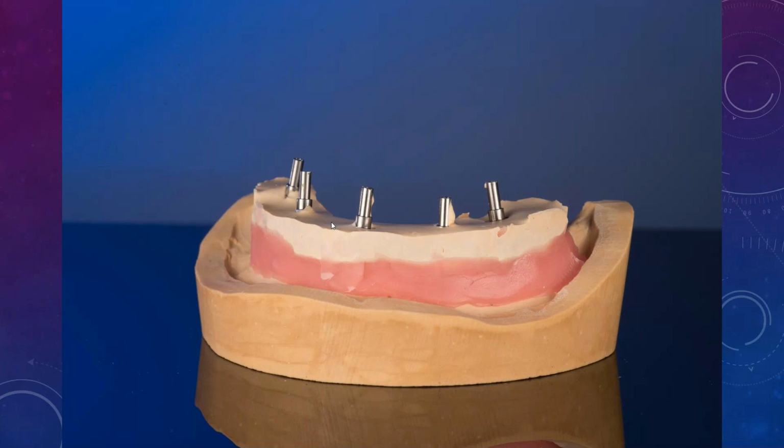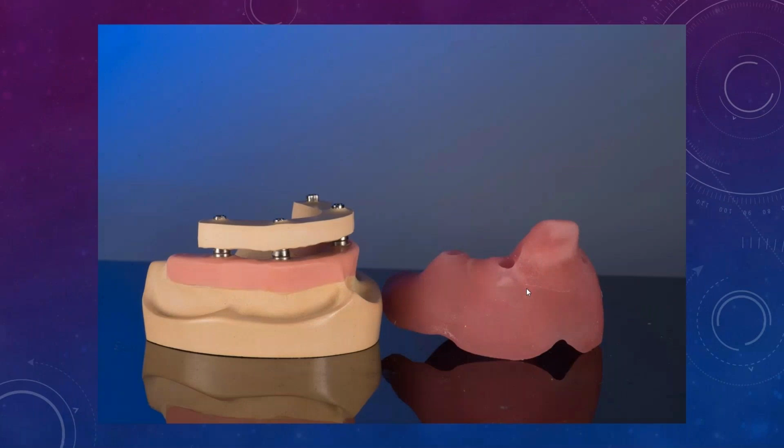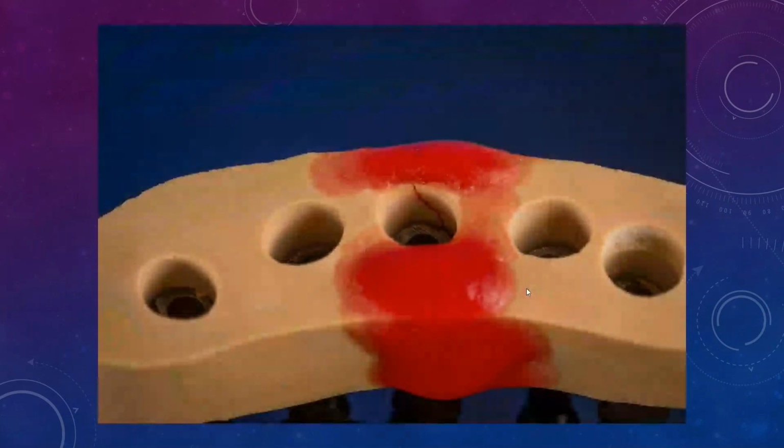stone jig that's open, because if the stone jig doesn't go in there passively and ends up being fractured, you need to lute that stone jig together, and then you have to take a whole new impression. And you want to have enough room underneath that verification jig to where you can inject silicone to trap it within your impression, so to speak. Okay, you can see right here I have plenty of room underneath, and then you make a custom tray to fit on top. And if it snaps intraorally, you want to make sure you load it with either pattern resin or composite to get things done.